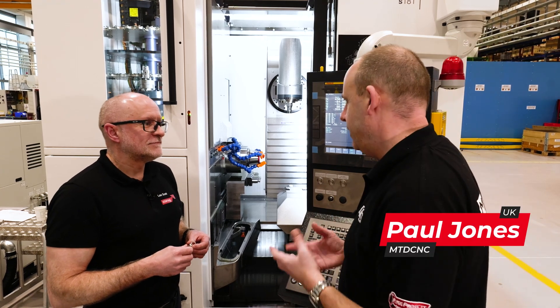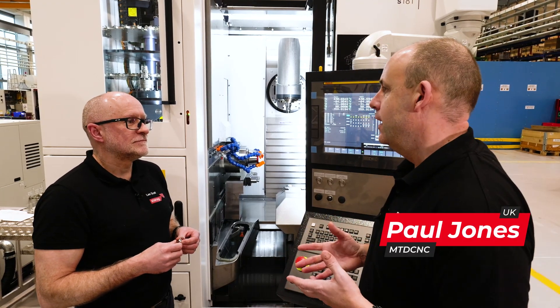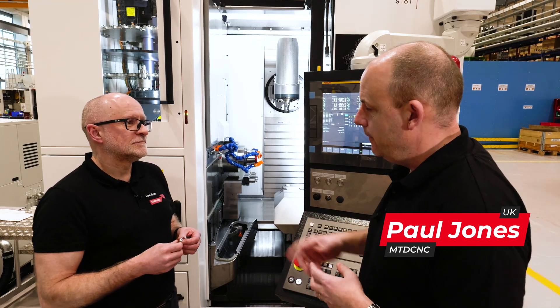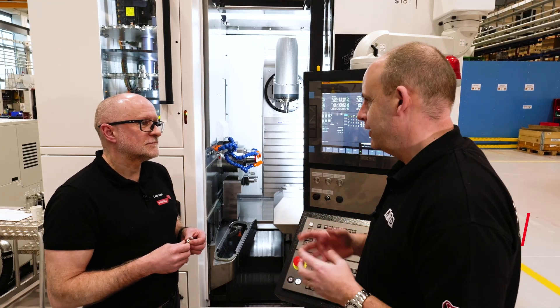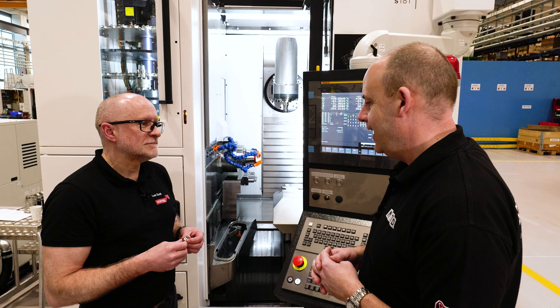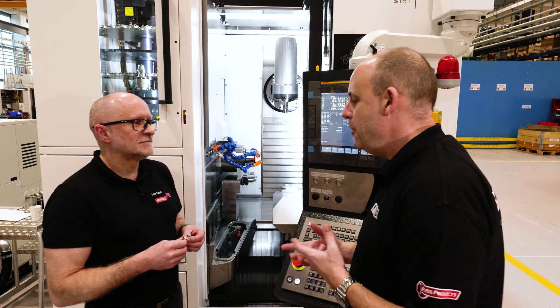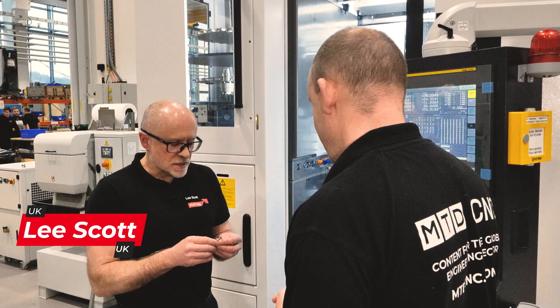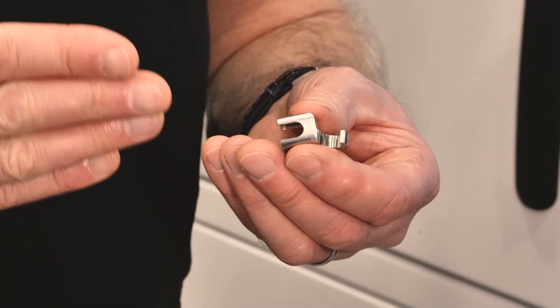The BoombaTec 181 machine is perfectly placed to participate and make parts for the medical sector. One of the parts — and these are really interesting — one of the parts you've got there is done on this machine. This is a surgical hook, so it's a component that's manufactured in volume.